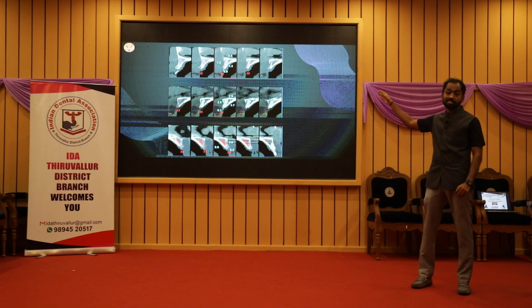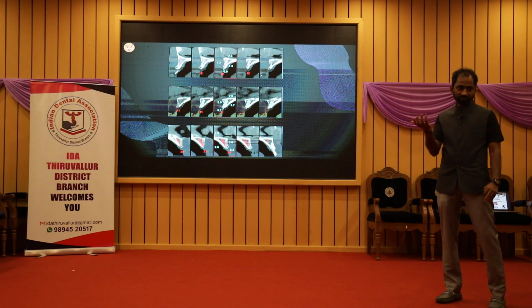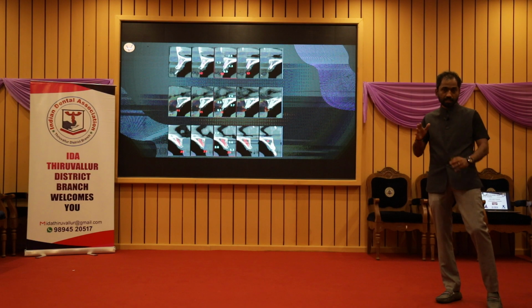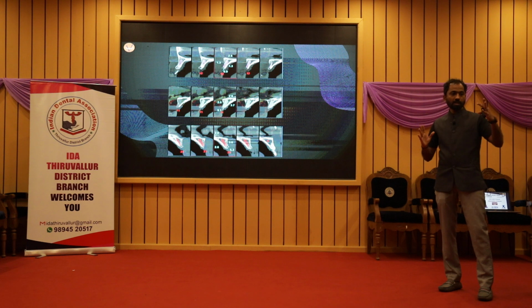What you see in the CBCT, usually what happens is, in the CBCT we feel there is no bone, but when you open it, you will get some more bone. The other way is very rare, because they will maximum put it in the bottom line only, no chance, like that only they will tell. But when you open it up, you will get some amount of bone. On top of that, if you do osteodensification, you get much more.